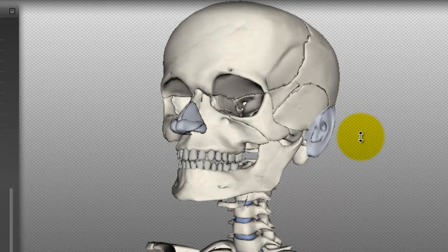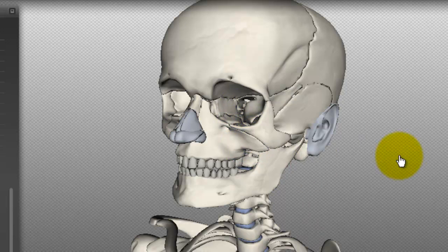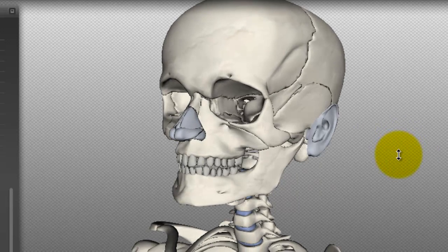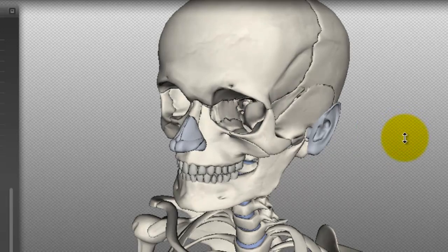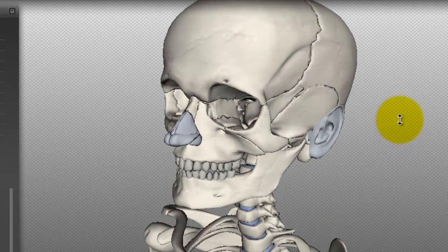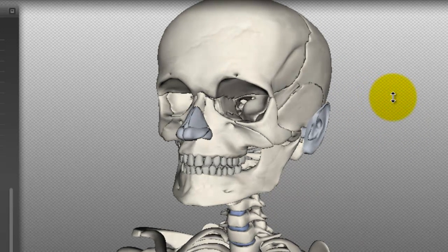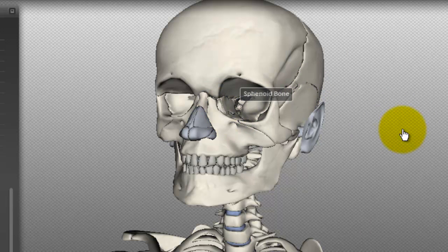If the chin is elevated too much, you can see the optic foramen being posterior to the inferior orbital rim — it's going to be dropped down below it. If the chin is tucked in too much, the more the chin is tucked, the higher the foramen is going to go. If you're under-rotated, the optic foramen is going to sneak in behind the ethmoid bone — it'll be too medial and eventually hidden. If you're too rotated, it's going to be out towards the lateral margin of the orbit.